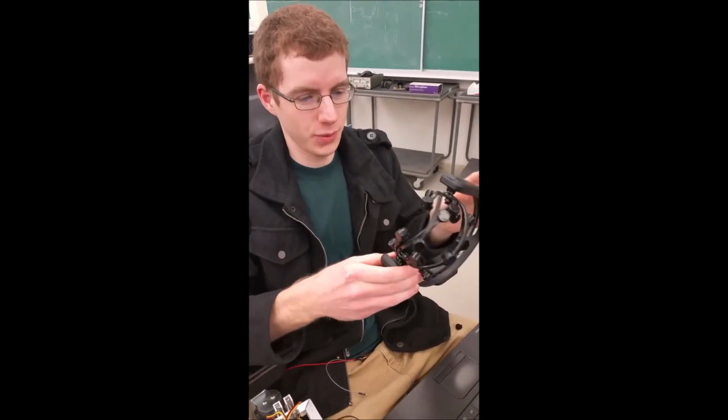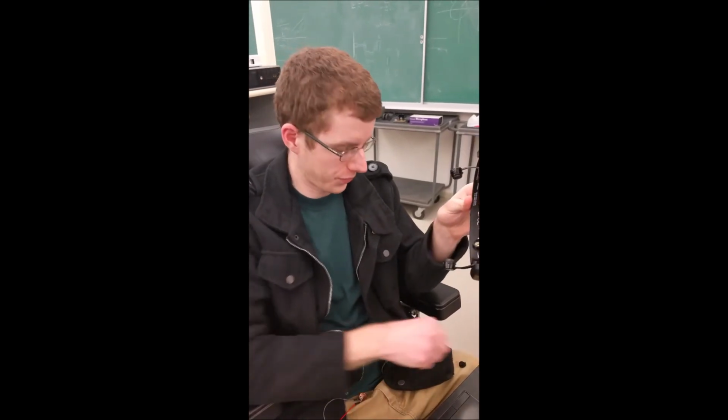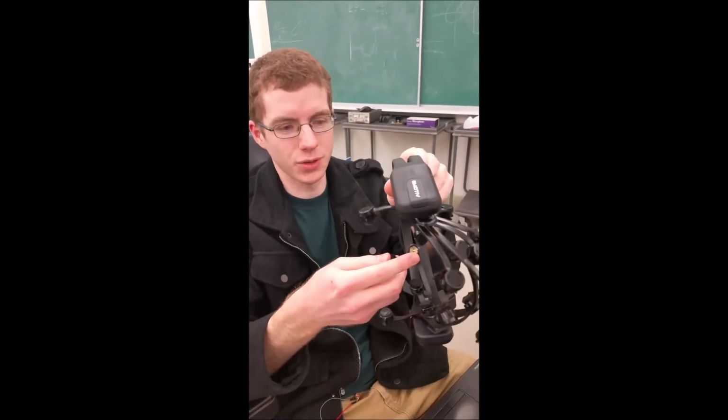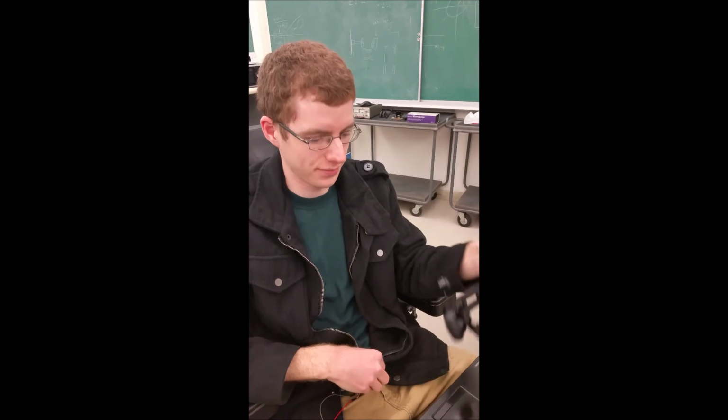So the way it works, it has 14 channels of information, measures mostly the premotor cortex and the frontal lobe. And so there are felt sensors on the electrodes that get past the hair, which are soaked in saline solution, which helps the conductivity. And that's what we use for the EEG aspect.